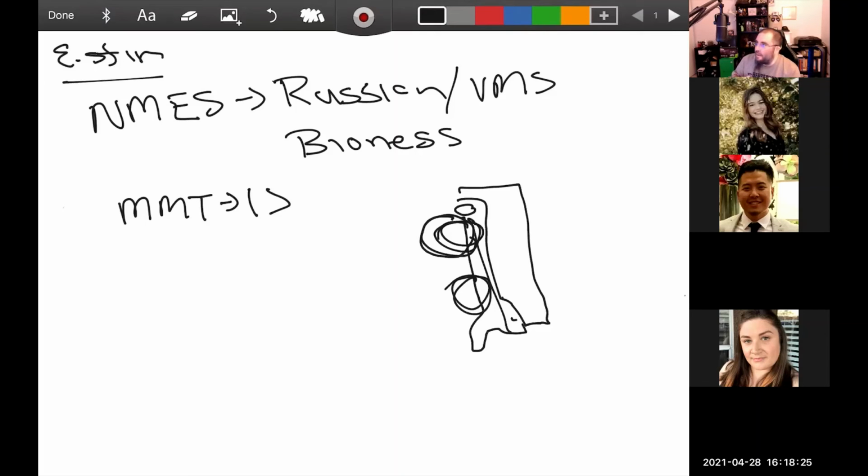Now, even the best clinician will get a little bit of eversion when you're doing dorsiflexion, because the peroneals are there too. You're going to get a little bit. What you may see is a little bit of eversion, then it goes up into full dorsiflexion. You want to make sure that you crank it up a little bit before you start going, oh, maybe I need to move pads because I'm getting a twitch of eversion.